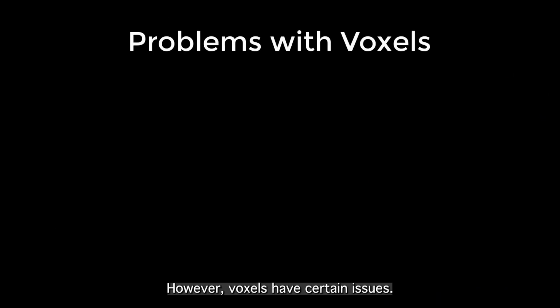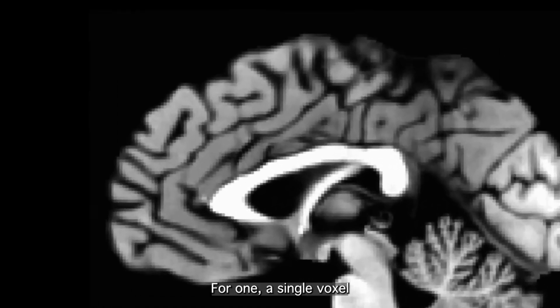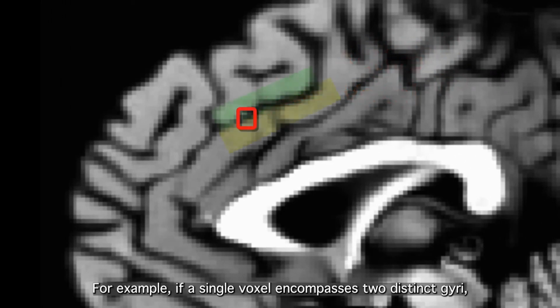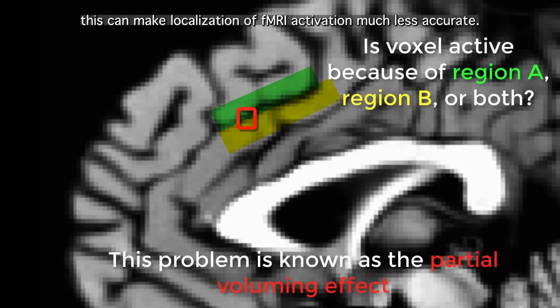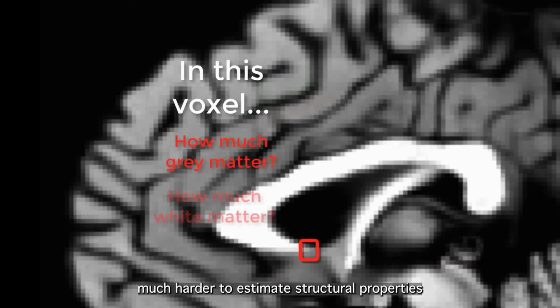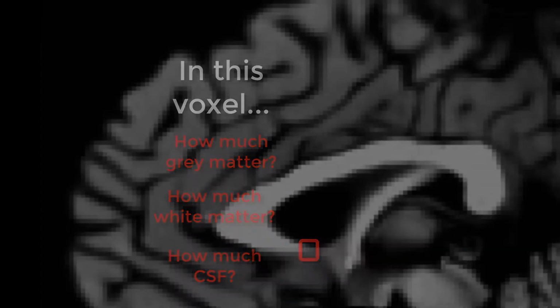This is fine for most fMRI analyses. However, voxels have certain issues. For one, a single voxel can encompass information from two anatomically distinct areas. For example, if a single voxel encompasses two distinct gyri, this can make localization of fMRI activation much less accurate. Another problem is that with voxels and volumetric data, it's much harder to estimate structural properties, such as gray matter thickness and gray matter volume.